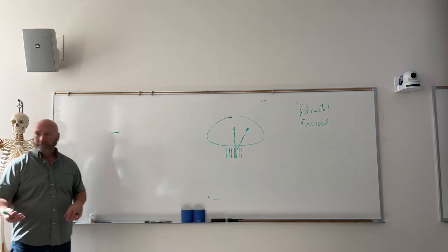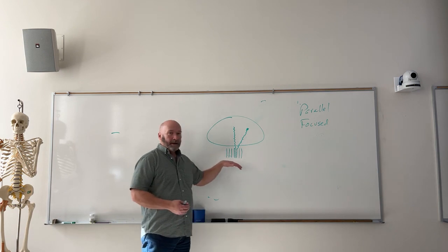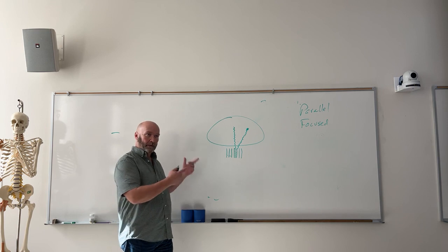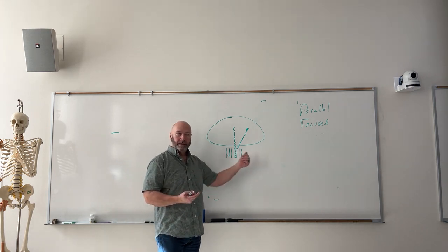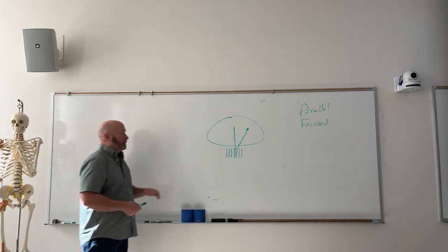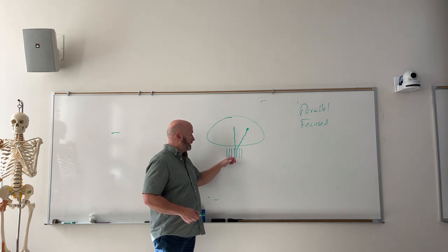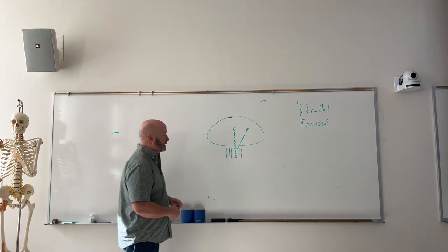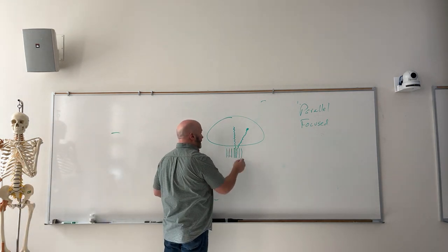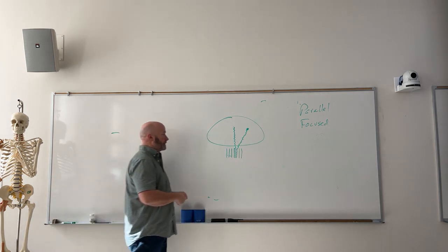So plastic is better, right? You don't have that kind of problem. So the interspace material can be made fundamentally of anything, as long as it's radiolucent, number one, and number two, it doesn't distort whenever it gets wet, if it happens to get wet. But the grid strips are always going to be lead. So it's going to be lead, interspace material, lead, interspace material, lead, interspace material. So how do we make it to where we transmit as much of that as possible while blocking that? Well, we can do a number of different things.